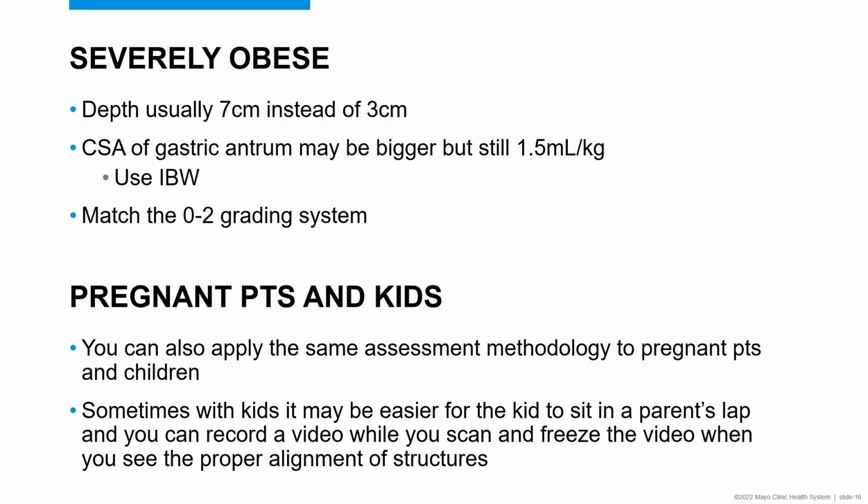And now for other special patient populations, pregnant patients and kids. You can apply the same assessment methodology to pregnant patients and children. Sometimes with kids, it may be easier for the kids to sit in a parent's lap, and you can record a video while you or the parent scans. Then you can go back and freeze the video when you see the proper alignment of structures and do your assessment.